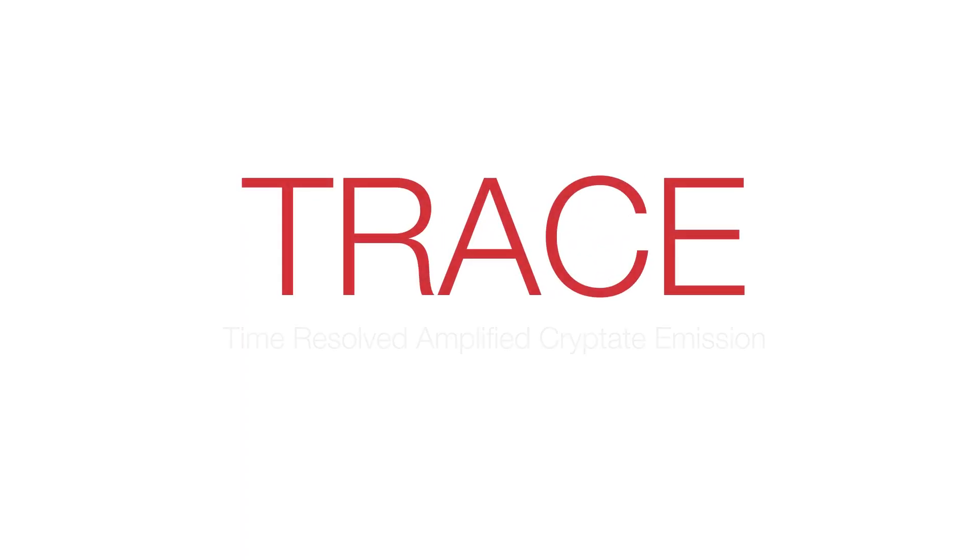TRACE technology simplifies your workflow and delivers answers you can trust.